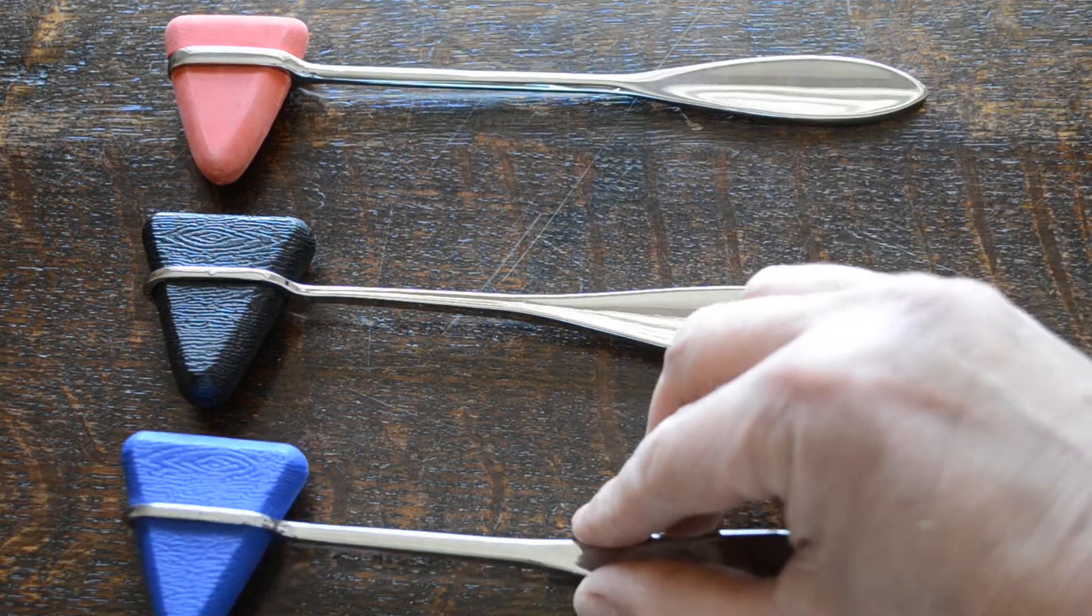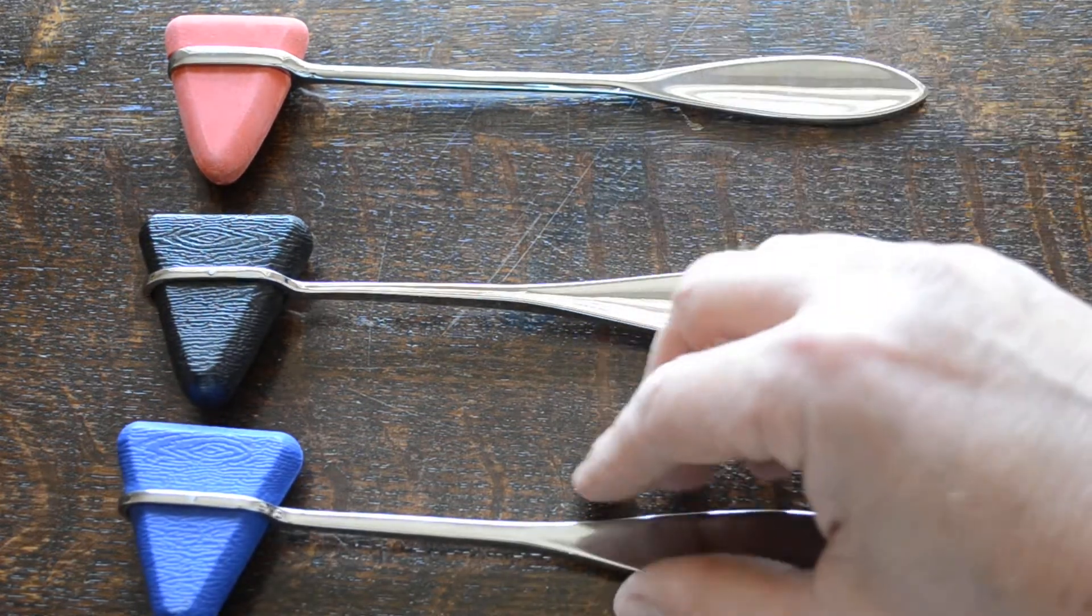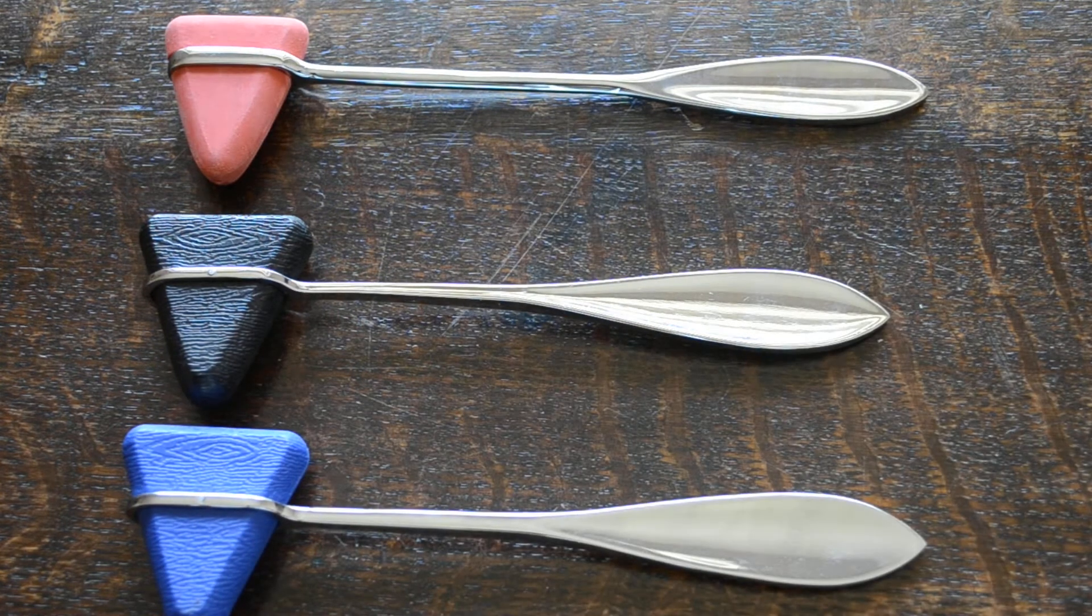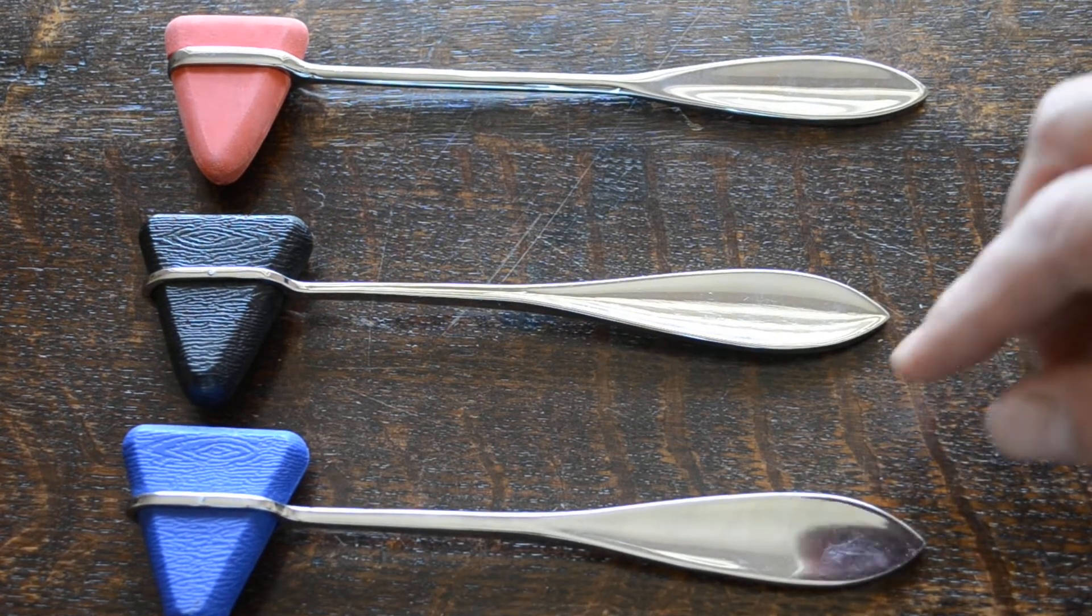The two lower models here are variants of the same design. They're basically a black-headed and a blue-headed with a rigid plastic head which is non-removable.